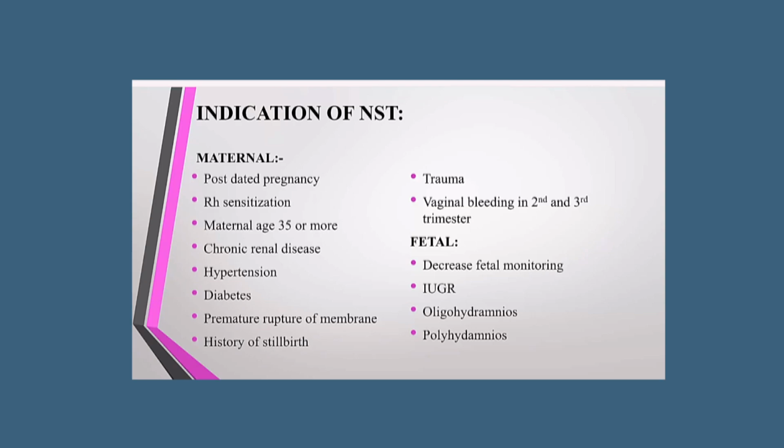Here we can see the indications of the non-stress test. They can be divided into two: maternal and fetal. First the maternal indications: postdated pregnancy, Rh sensitization, maternal age more than 35, chronic renal disease, hypertension, diabetes, premature rupture of membranes, history of stillbirth, trauma, and vaginal bleeding in the second and third trimester.